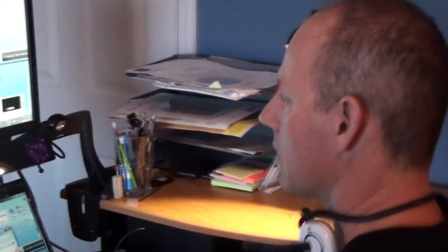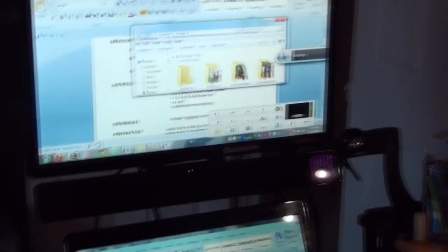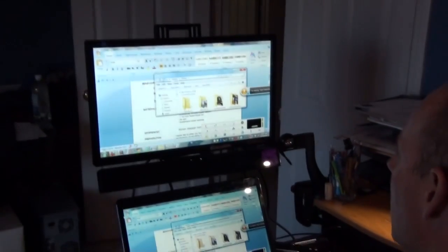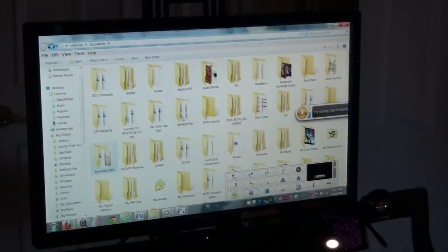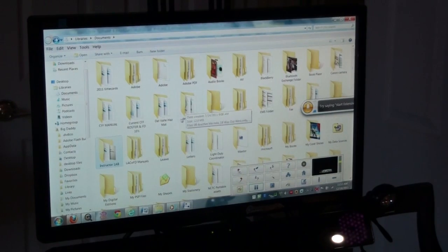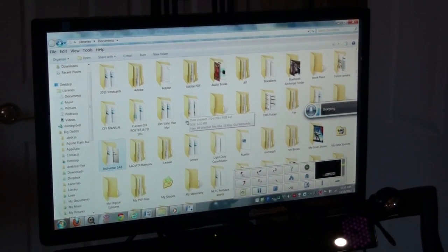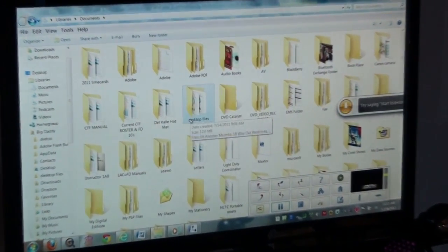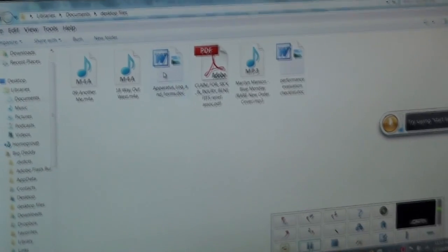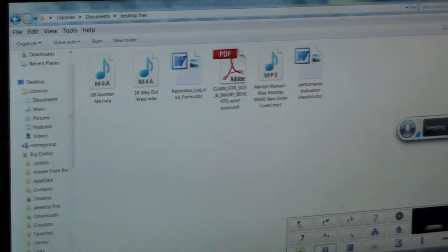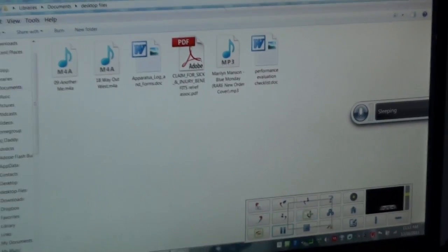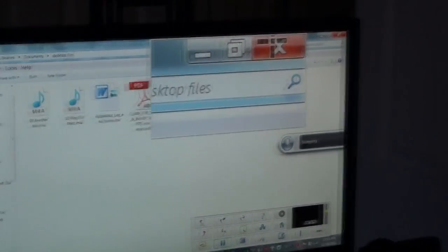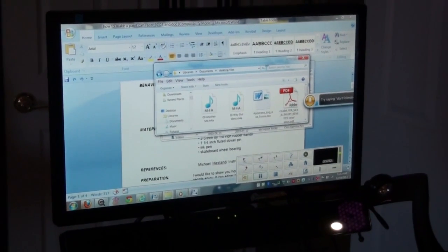There's a couple of other really neat features for it, and here's one of them. You can copy and paste things quite easily. I go to the file that I want to find, in this particular case I have a file called desktop files, so I'm going to open that. And I just hold a long blink, and that double clicks and opens this up for me. And then what I'll do, is I'll use my magnifying glass to reach up in here into the corner, and I will minimize this particular file.